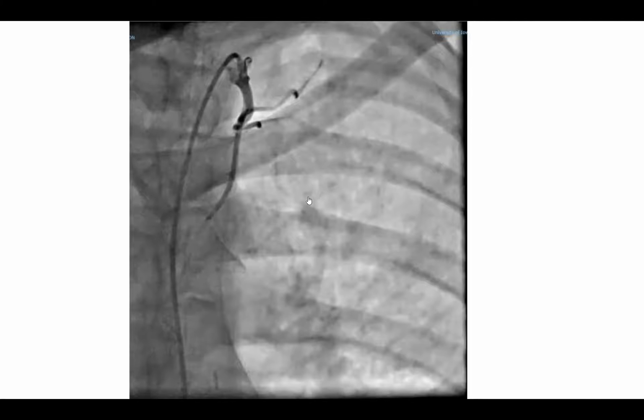We do a big volume, around 10 to 12 milliliters if you have an automatic injector like the Assist system. That will generally give you good views. The blood pressure cuff will divert flow away from the arm into the LIMA preferentially. Okay.